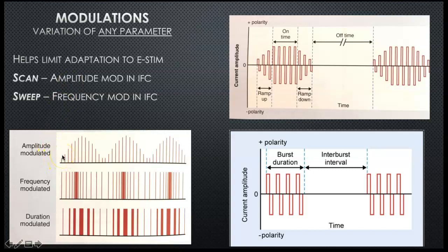Remember, amplitude is like how strong it feels when it's on you. So the intensity turns up, right? It starts out low and then it's gradually getting really strong and then it's coming down again, and it's going up and getting really strong and then it's kind of backing off again. So that's what it would feel like. It would get stronger and less strong.